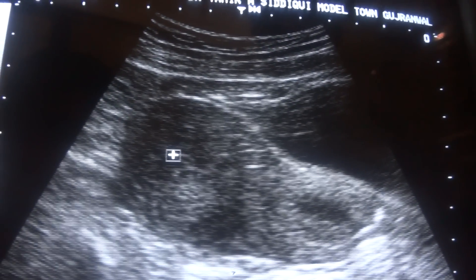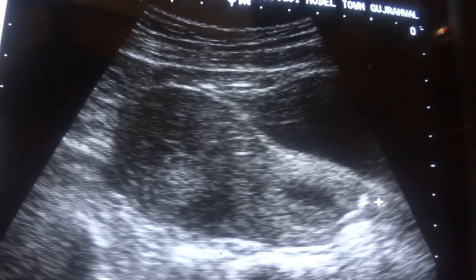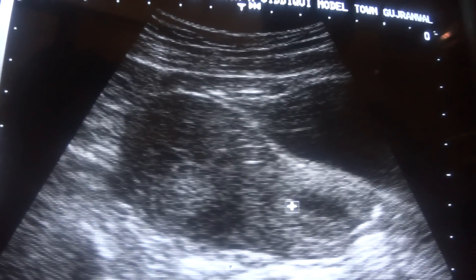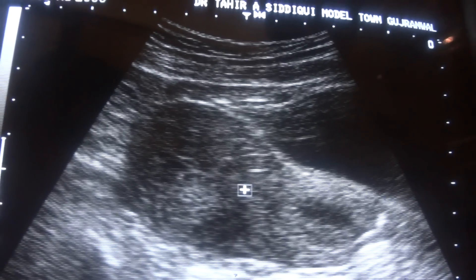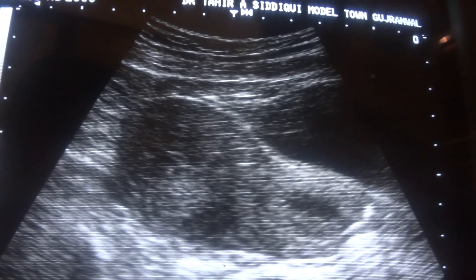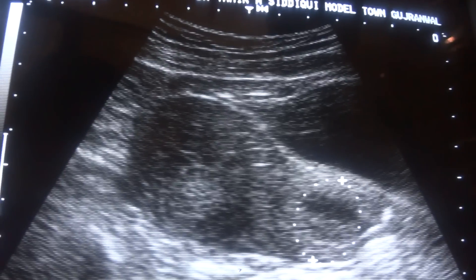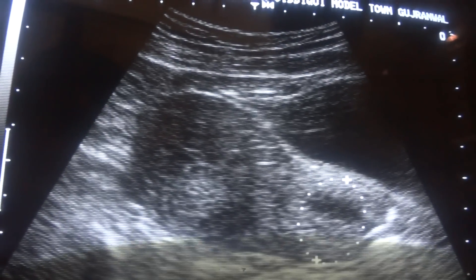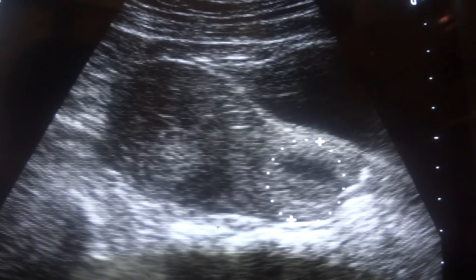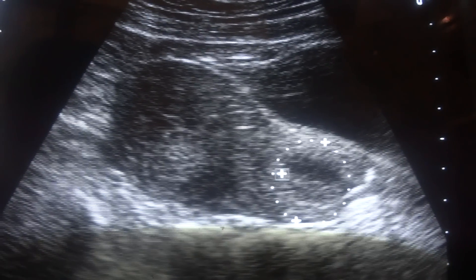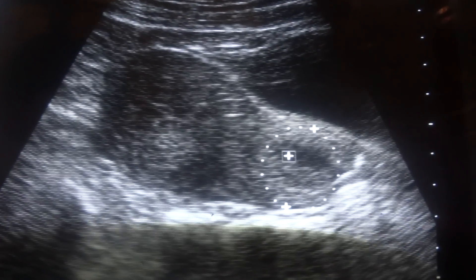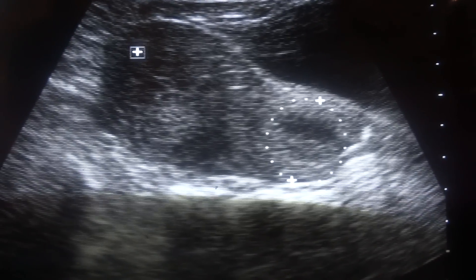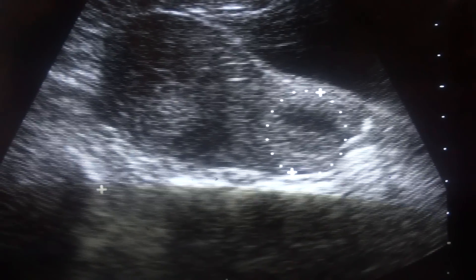This is the endometrial canal in proliferative phase. This is the cervix and this is the cervical canal. Small amount of fluid is seen in the cervical canal. This is the anterior segment and this is the posterior segment.